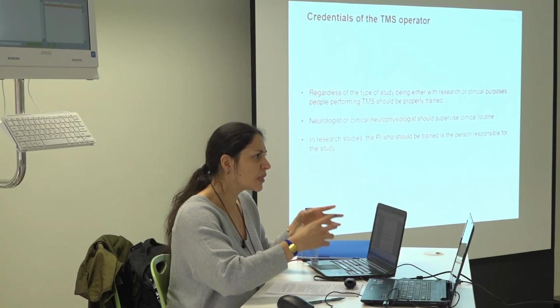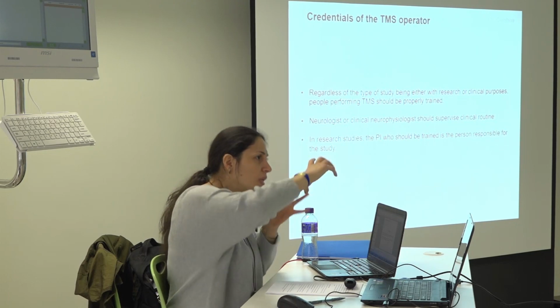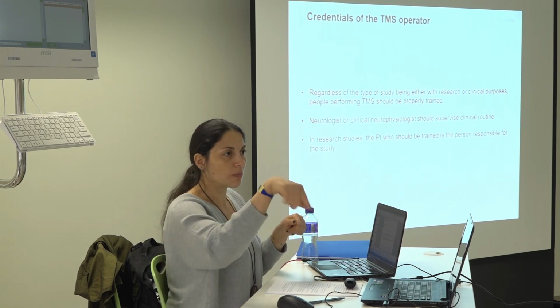So train, hold the coil, see how it feels, how tiring it is when you have to hold the coil for a long time. Fortunately, you have a lot of stuff here which I don't use because it doesn't work sometimes. It's more difficult to try to accommodate the coil sometimes. So training is the thing. Once you know the safety measures, play with it and train among yourselves.